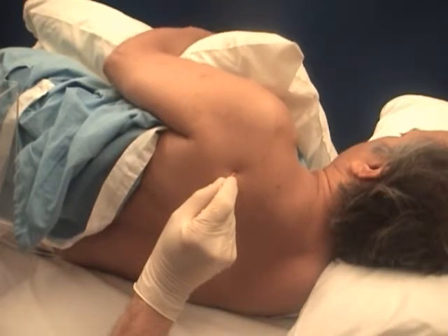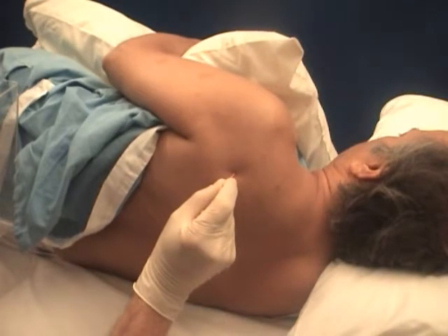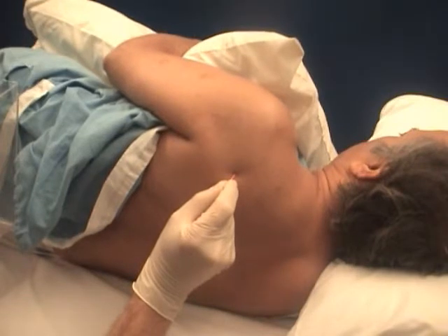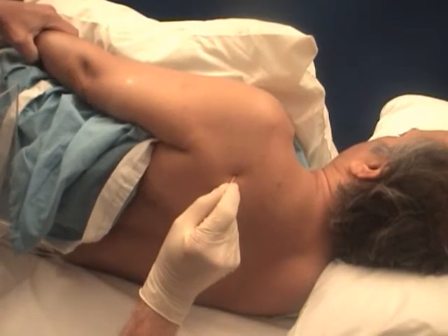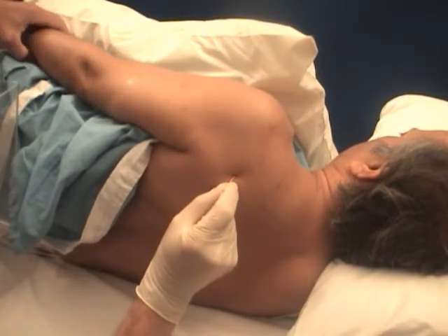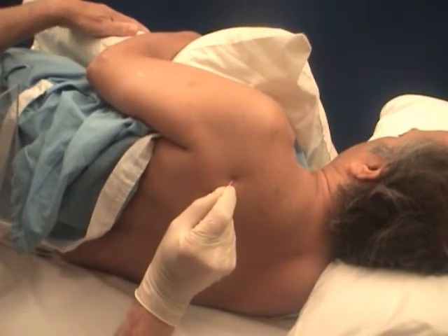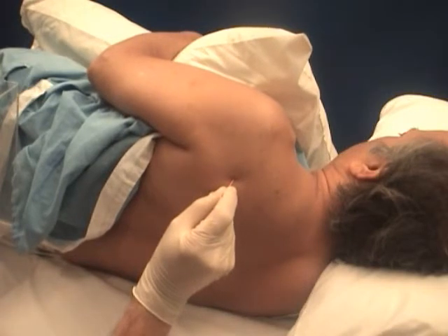Observe the movement of the forearm. Occasionally, patients cannot relax the muscle enough to assess spontaneous activity. Relaxation of this muscle can be achieved by resting the arm along their side, or the use of what this author calls the sweetheart pillow, which is placed in front along the patient's abdomen, allowing greater relaxation as they allow their arm to hang down over it.